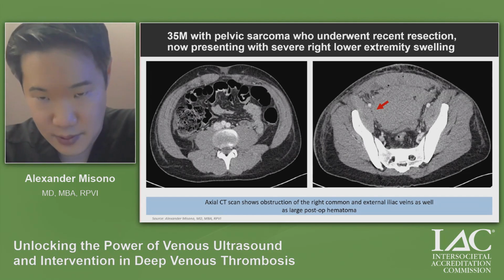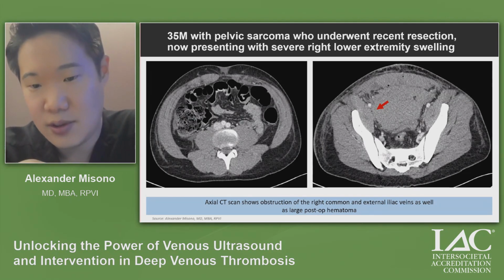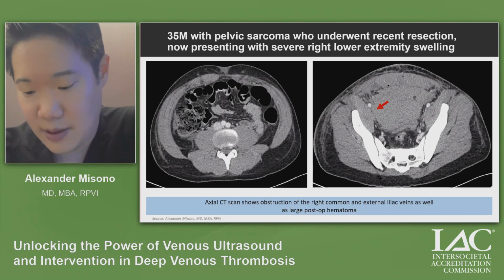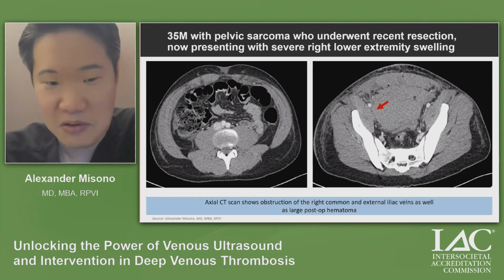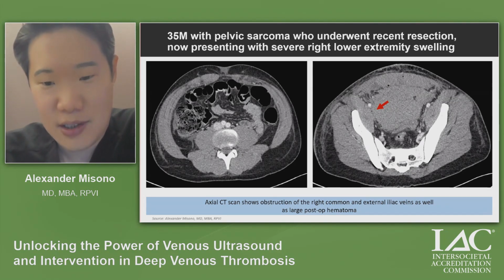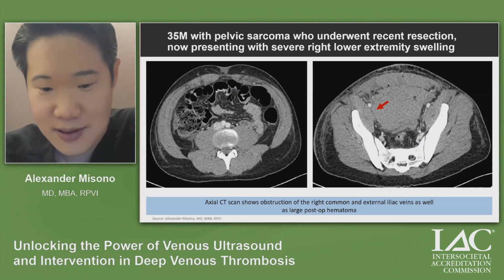So actually, before I get to the next slide, I'll add also that I learned after talking to the surgeon, this was a resection case, that there was some bleeding out of that external iliac vein during the procedure. And they ended up having to sew that area shut. So there was probably a combination of a bit of a laceration there, and then an iatrogenic almost closure of that vein. So I am now dealing with something that should give all of us a little bit of heartburn. I'm having acute DVT. I have a potentially sewn shut, iatrogenically closed external iliac vein and a significant hematoma.